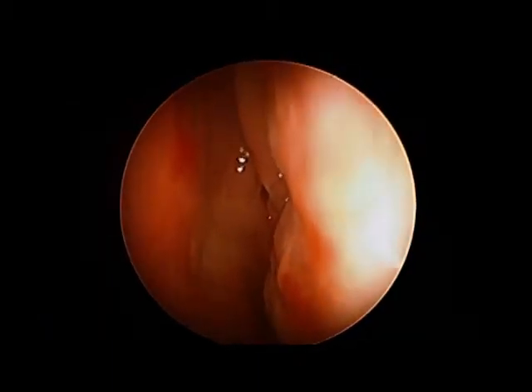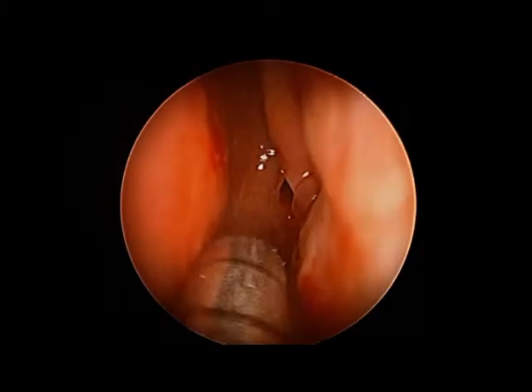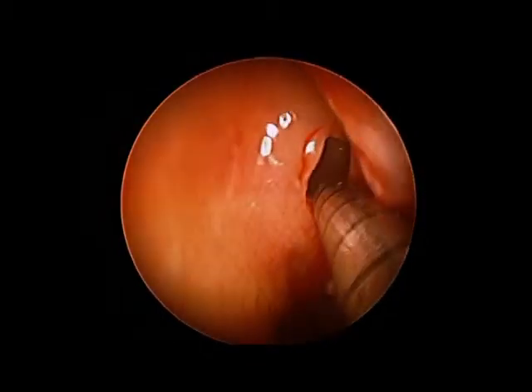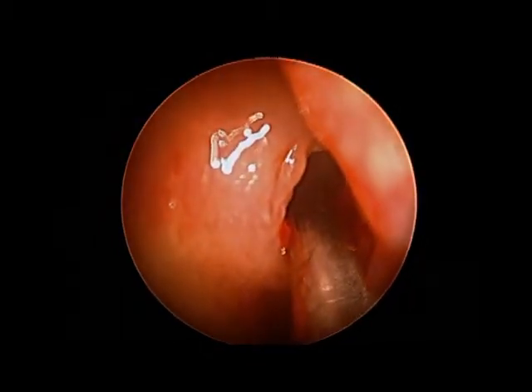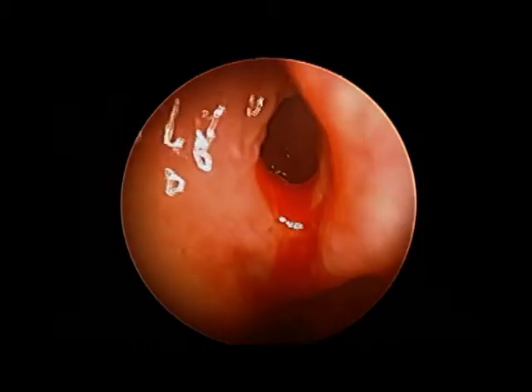As you can see, there is minimal mucosal trauma and the outflow track is much wider than it was at the start of the procedure.